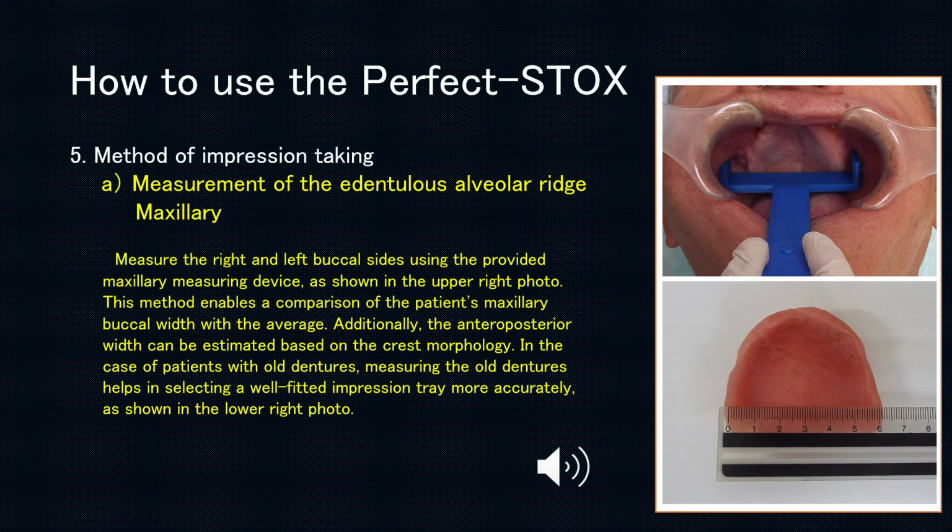In the case of patients with old dentures, measuring the old dentures helps in selecting a well-fitted impression tray more accurately, as shown in the lower right photo.